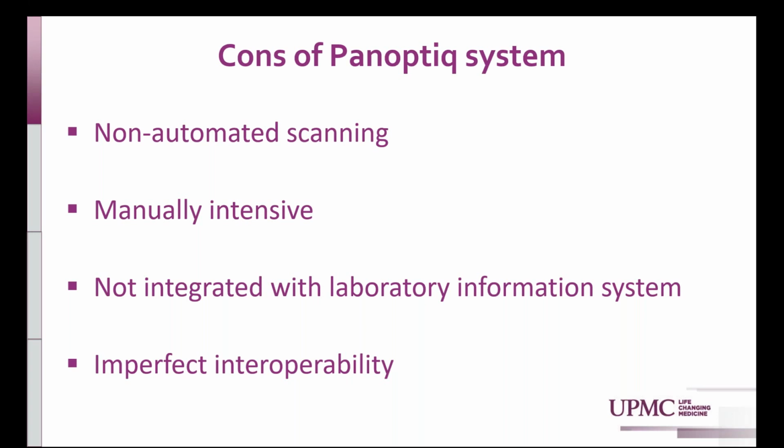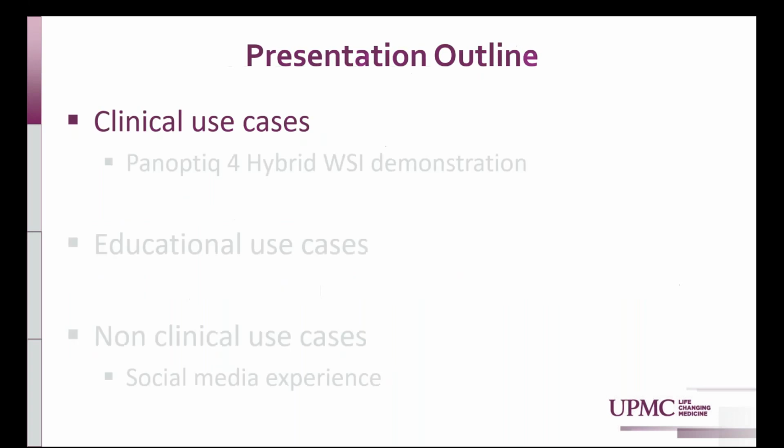And lastly, the output slide of the Panoptiq whole slide image is an SVS slide. However, each magnification plane and Z-stack is a separate file in the folder directory. This is non-contributory for when the user views the Panoptiq whole slide image in the Panoptiq viewer or portal, and the image can be seamlessly viewed, but not all of these features can be leveraged or taken advantage of in other vendors' whole slide image viewers.